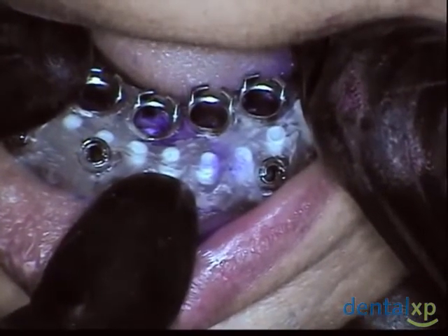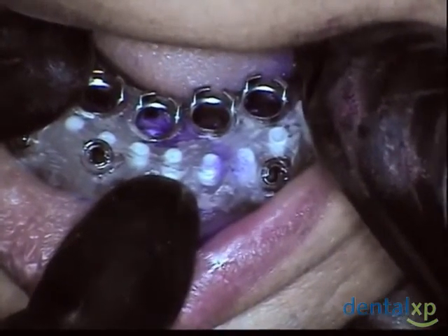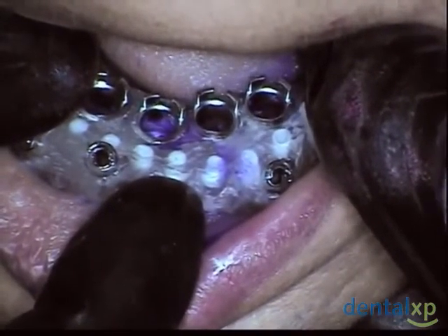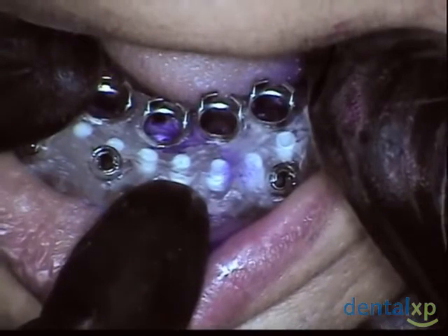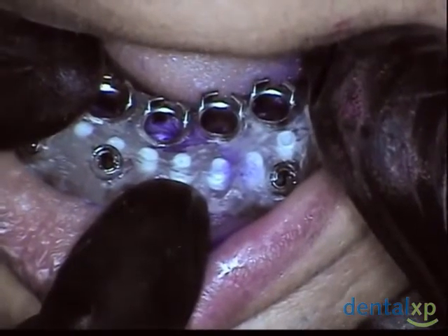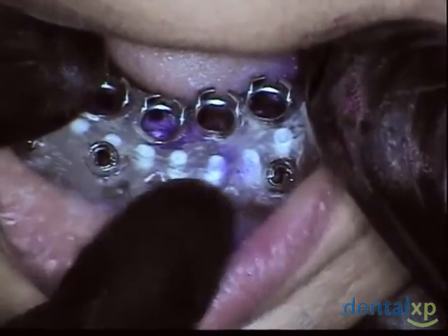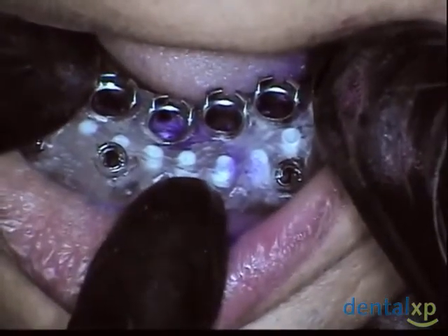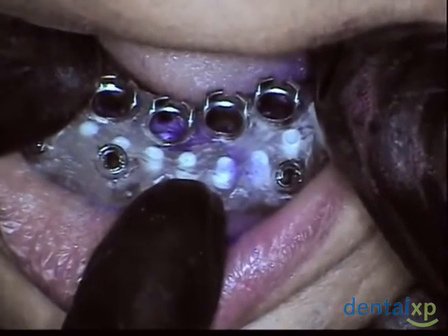This system allows you to treatment plan with you and the lab together, proactively deciding where you're going to set the teeth based on where the implants are going to be placed, based on the availability of bone. Even if you choose not to do a case, it is a wonderful diagnostic tool. You might look like you have a wonderful ridge, do the CT scan, and find the ridge is not what you thought — nor is the quality of the bone — so you'll quantify and qualify the bone before entering the surgical region.